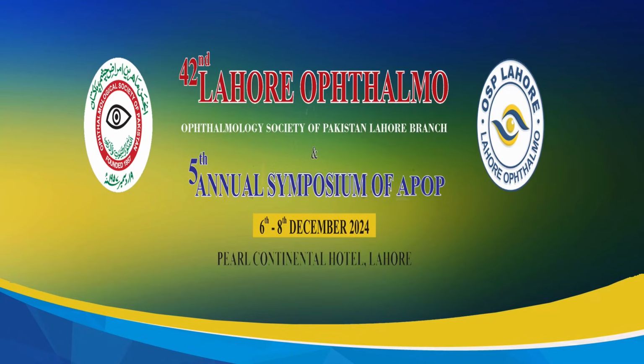अच्छा, उसमें बात ये है कि जो फ्रेश ब्लड होता है, यू आर एबल टू रिमूव इट विद अ कटर, और इसमें इंडेंटेशन आप ज़रूर करें, क्योंकि कई दफ़ा आपके व्यूइंग सिस्टम में यू कांट गेज कितना डीप आप जा रहे हैं. सो अगर आप इंडेंट कराते हो तो फिर आपको बहुत 3D इफेक्ट मिलता है और बहुत आराम से आप रिमूव करते हो. और बेटे, द इंफीरियर ब्लड इज ऑलवेज देयर इन फ्रेश ब्लड बिकॉज द ग्रेविटी टेक्स इट इंफीरियरली, सो हमेशा ही मिलता है आपको एंड यू शुड रिमूव इट.